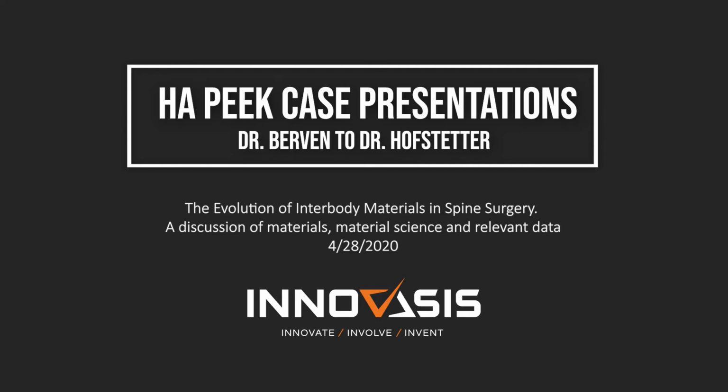Generally, I'll use a large kit, which is 12 milligrams, and I'll tend to use a third of a large kit per level, so 4 milligrams per level, and I mix it with a non-compressible matrix. Okay, so I use the smallest level. We published a meta-analysis many years ago, which was quite a lot of work, and we saw that with more than 8 milligrams a level, you get osteolysis. So I use the smallest dose. I've not seen any issues. I think the therapeutic window is, we're overshooting a little bit with that drug, but we'll see. I think it's going to be interesting once we see those fusion rates. I think I might completely omit it for my ALIFs. I think it might not be necessary.